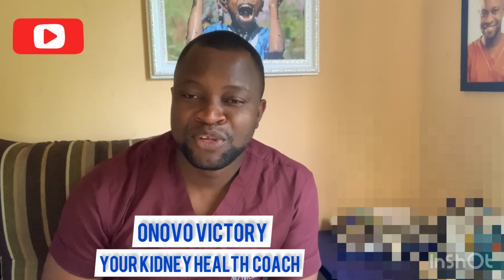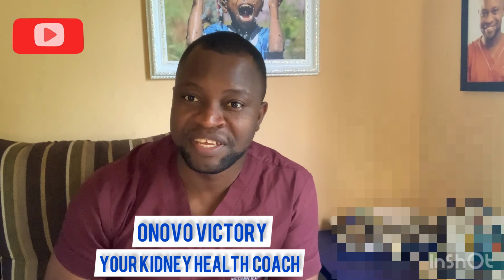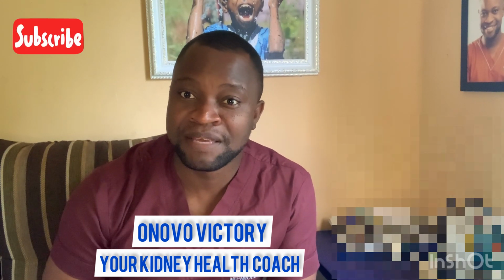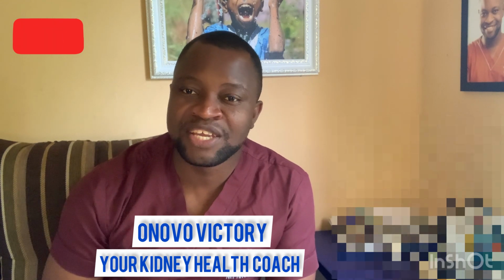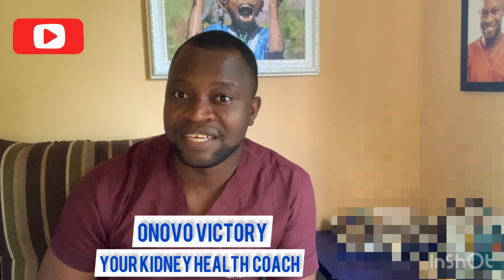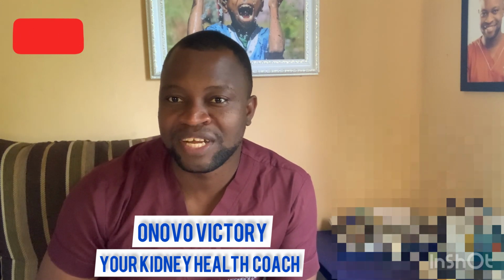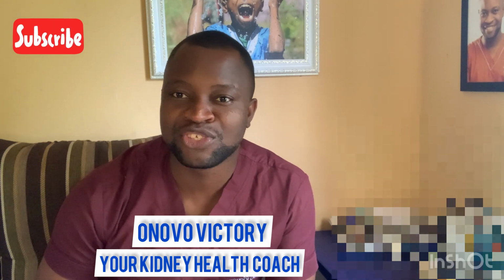If you check your blood sugar at home, here are 7 rules you must obey if you don't want to make the same mistake millions of people are making out there. Number one is that you have to determine if you're going to be doing random blood sugar tests or fasting blood sugar tests. What is the difference between a random blood sugar test and a fasting blood sugar test?